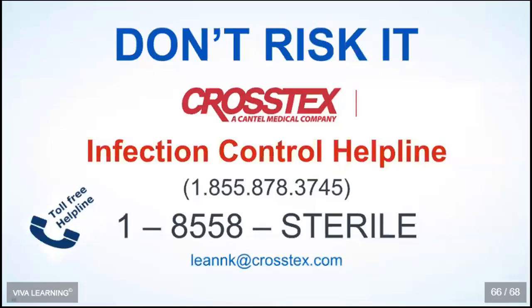With a multi-provider office, I really feel like we need a sterilization tech. I can understand this is a very complex process, and we need to make sure that the people that are in fact responsible for this have been appropriately trained when they started with the practice, and there should be at minimum annual training. And I will share with you, Christy, the CDC has a phenomenal checklist. If you go to the new summary document that was published by the CDC in 2016, there's a great section on instrument sterilization, and in the back there is an observational checklist that you can use to make sure that you're crossing all the T's and dotting all the I's. So the CDC 2016 summary document.